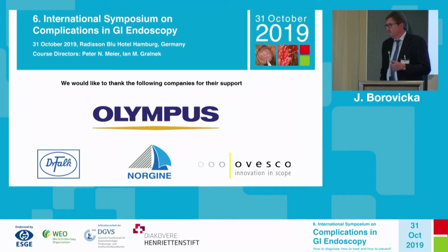And so meaning that it should be done in the fluoroscopy room? No, we do it immediately. We spray it on the perforation and look at it during the endoscopy. Achalasia is always done with an X-ray inside the room. So usually you should look if there is a perforation, if you think there is. But I wasn't there in the room, so I can't tell you how nervous the endoscopist was. We usually do a fluoroscopy after the procedure to make sure.